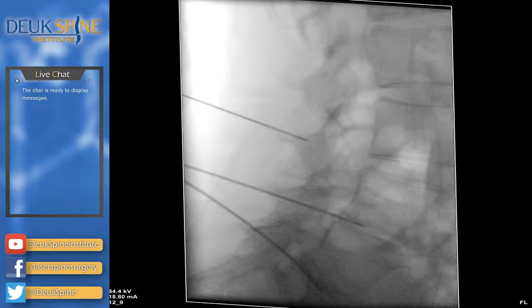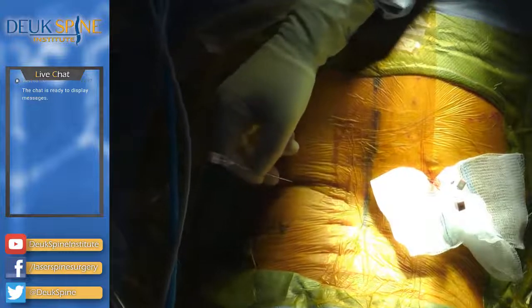Lay still. You all right? Shot. Shot. Shot. I have mixed feelings. Let's go AP and see where we are.